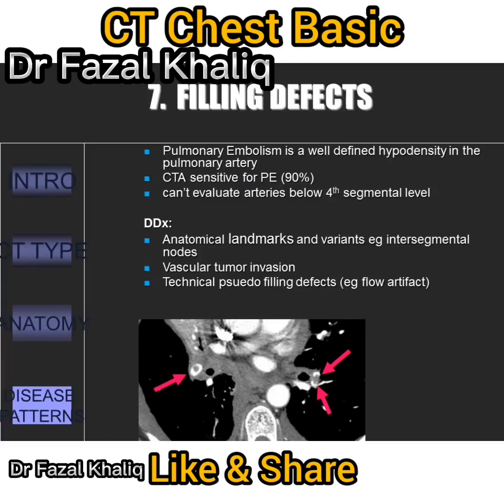There are some limitations to spiral CT. For instance, you can't evaluate the arteries below the fourth segmental level. However, the clinical significance of such subsegmental pulmonary arterial thrombi has not been established.